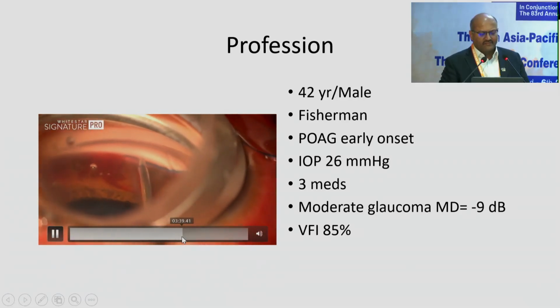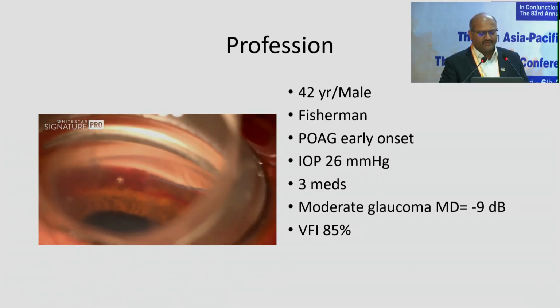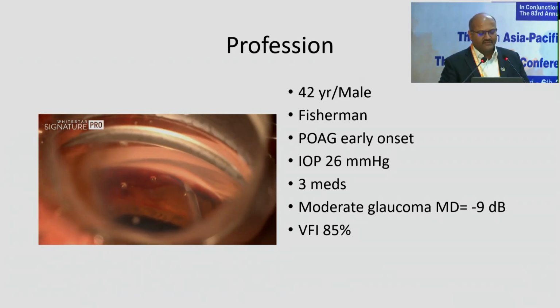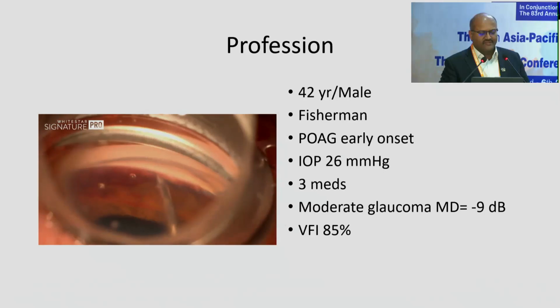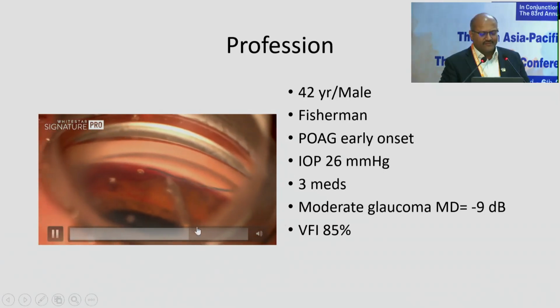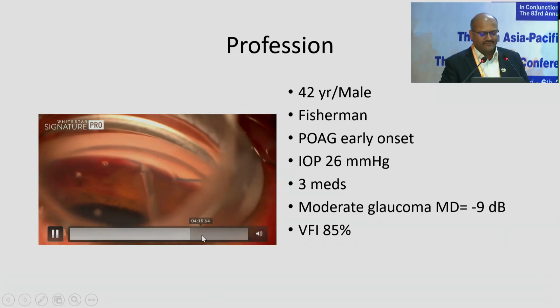So this is a very laborious process, and by the time we start the procedure, our staff will say, okay, sir, one of us is going for lunch. So it may take 5 minutes, it may take even longer than that, and that's how the process with GAT is. Every time you do it, it's always a learning curve.